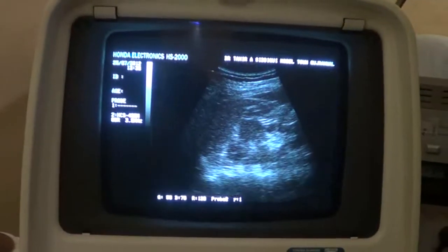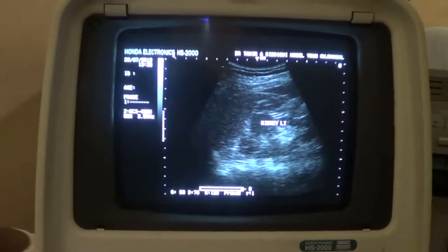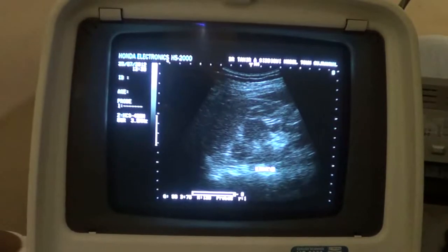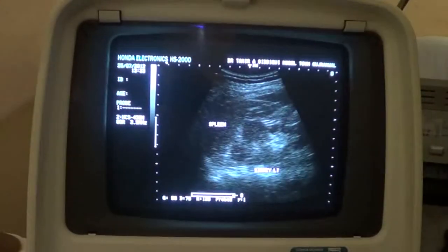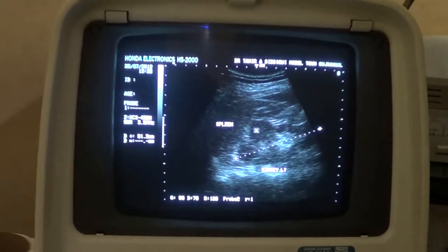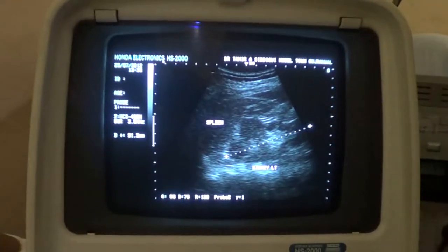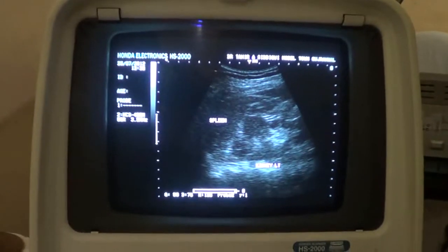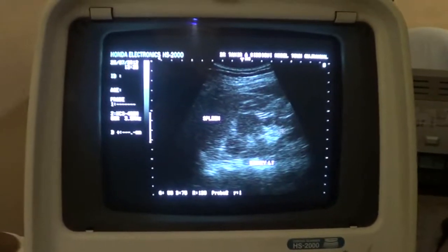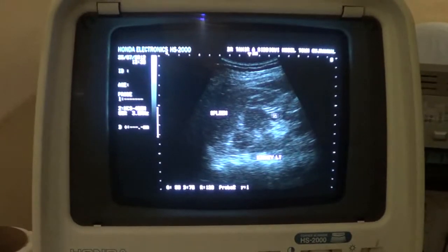This is the longitudinal section of the left kidney. The kidney measures 9.1 by 3.7 centimeters and is within normal dimensions. This is the central sinus ecocomplex. These are the pyramids and this is the cortex.